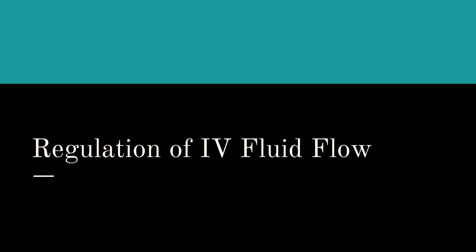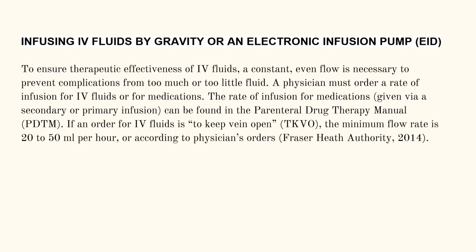Regulation of the IV fluid flow. So infusing IV fluids by gravity or an electronic infusion pump is typically how we've got those one or two options. To ensure therapeutic effectiveness of IV fluids, a constant, even flow is necessary to prevent complications from too much or too little fluid. A physician must order a rate of IV infusion or fluids or medications.